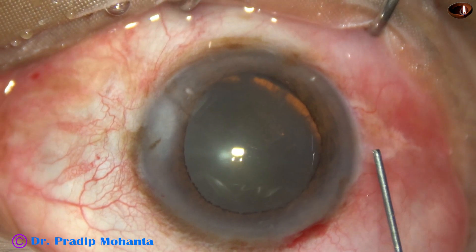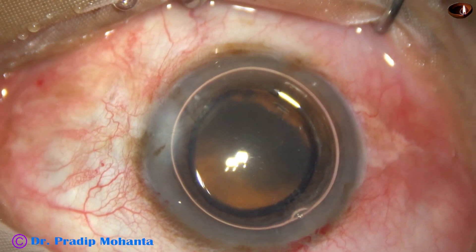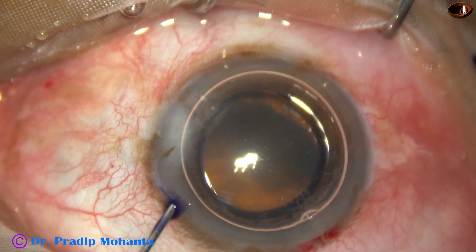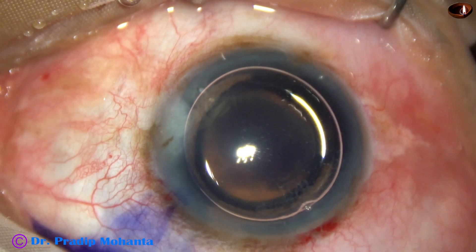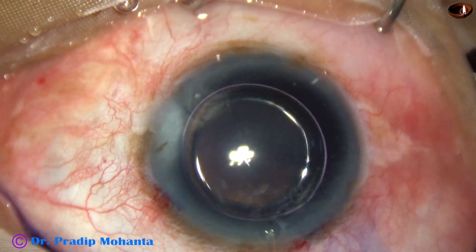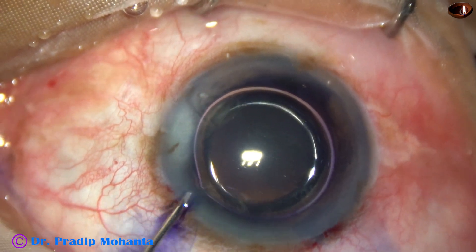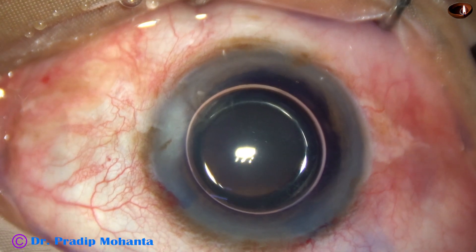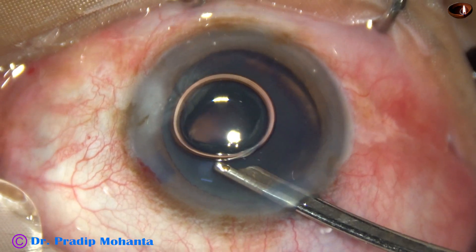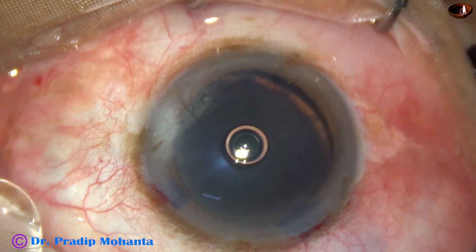An air bubble is injected to fill the anterior chamber. Underneath this air bubble, trypan blue 0.06% dye is applied over the anterior capsule. If we place the dye underneath the air bubble, the staining is quick and much better, and the dye doesn't touch the corneal endothelium. The dye is washed out and we can see uniform staining of the anterior capsule.